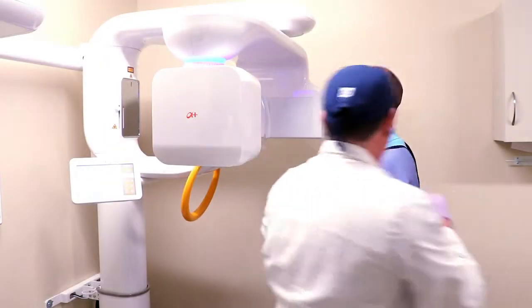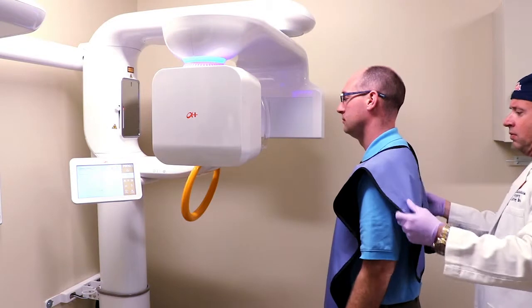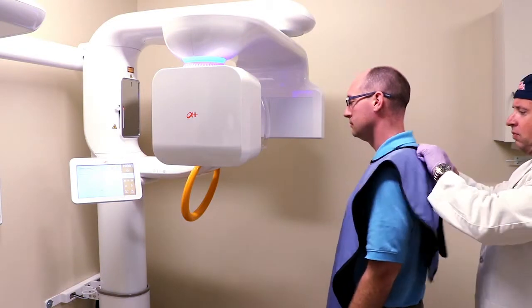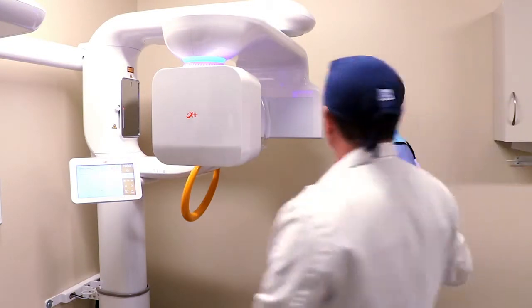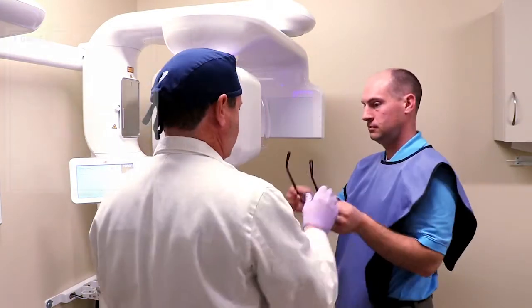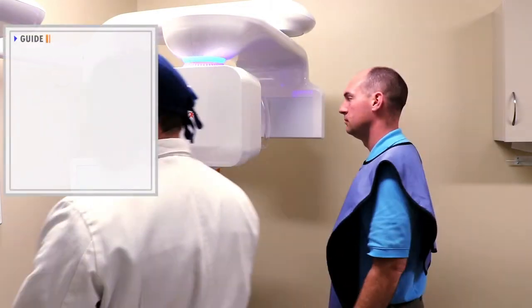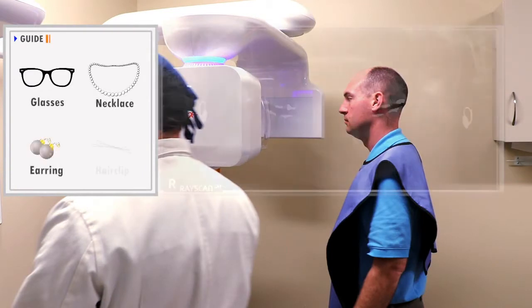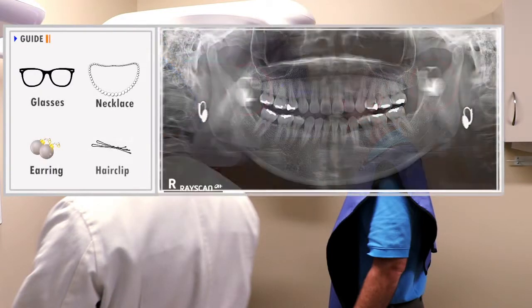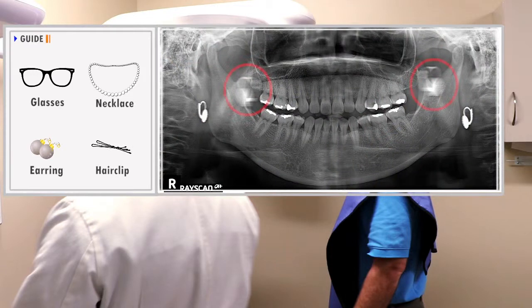Assist the patient to appropriately wear the lead apron. All jewelry and metallic objects such as eyeglasses, necklaces, earrings, and hair clips should be removed.